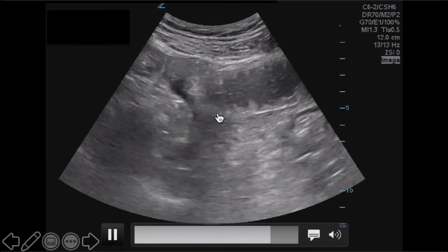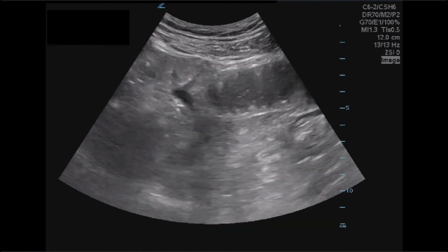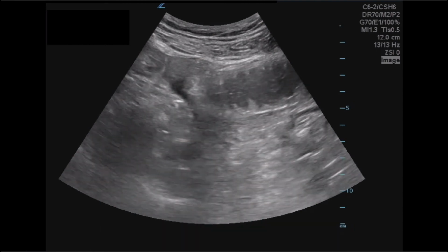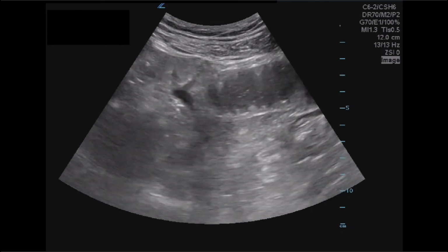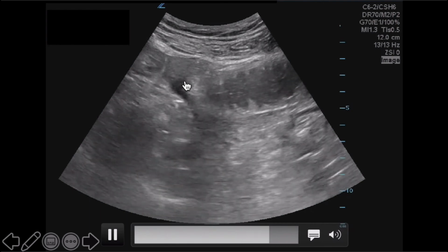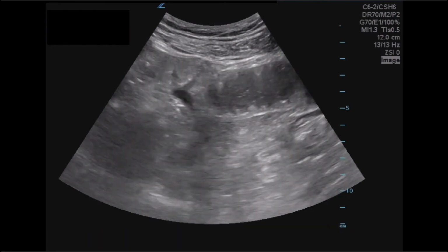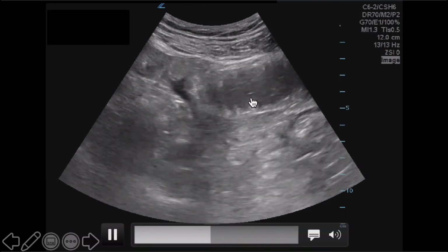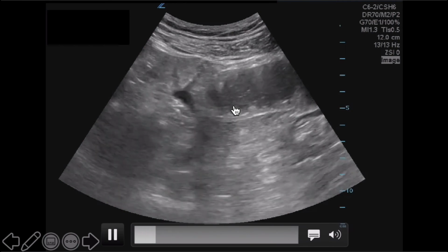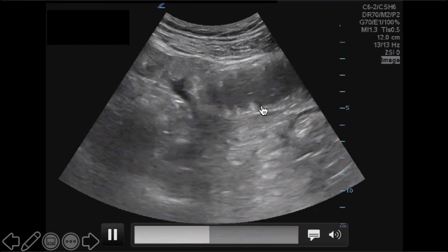This finding made the treatment team very suspicious for small bowel obstruction. The treatment team noted the abnormal peristalsis, the dilated loops of bowel, and edema outside the loops of bowel, also known as tanga, which we can see here. Additionally, the visualization of the plicae circularis became apparent in small bowel obstruction. These are the finger-like projections that extend into the lumen, also known as the keyboard sign.